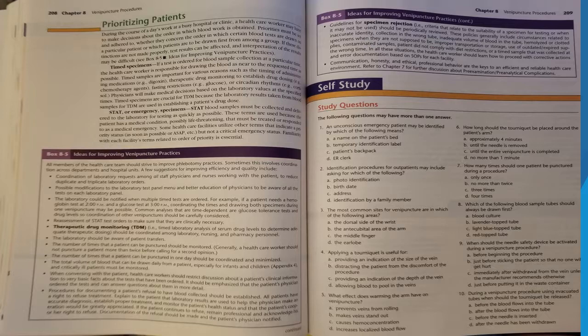Generally, a healthcare worker should not puncture a patient more than twice before calling for a second opinion. The number of times that a patient can be punctured in one day should be coordinated and minimized. The total volume of blood that can be drawn daily from a patient, especially for infants and children (Appendix 4) and critically ill patients, must be monitored.